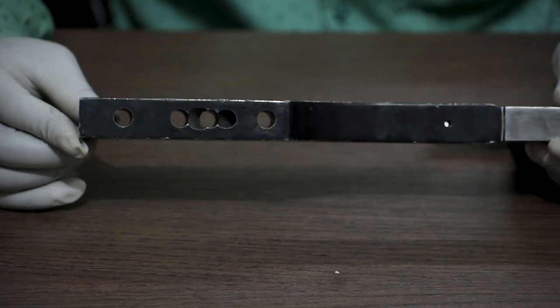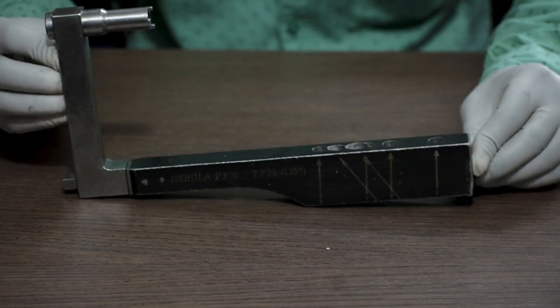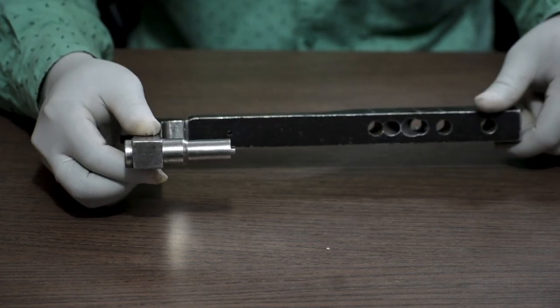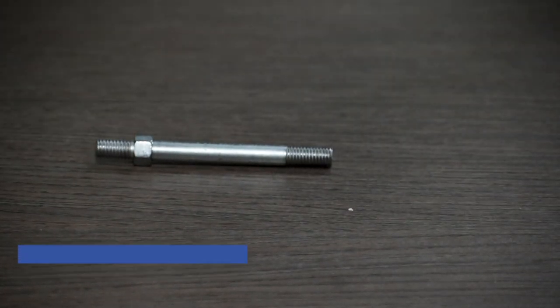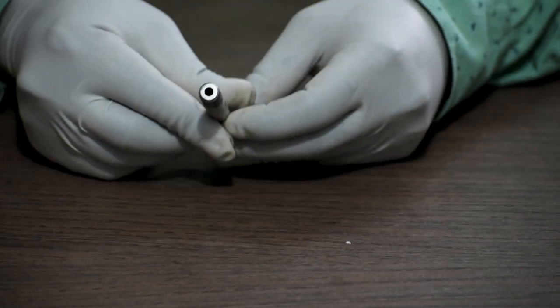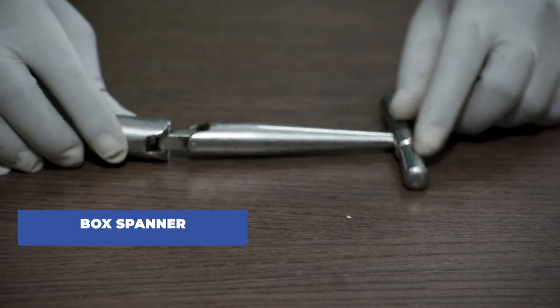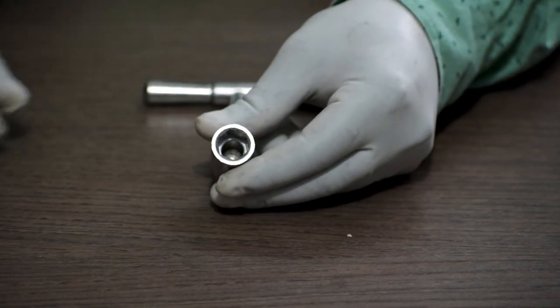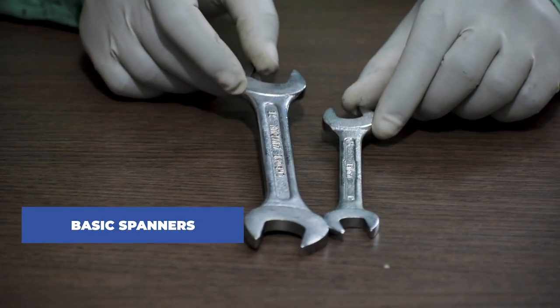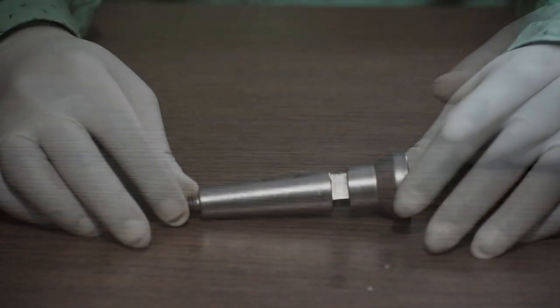This is a TFN jig for the 130 degree TFN. Here you can see there are options for the interlocking bolt to be fixed in the nail. And this one is a TFN jig for the 135 degree TFN. Next, this is a conical bolt. Next, this is a box spanner.